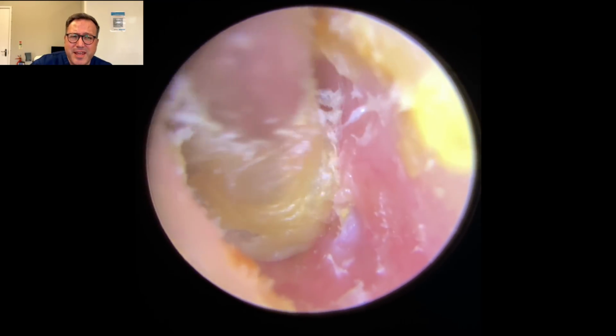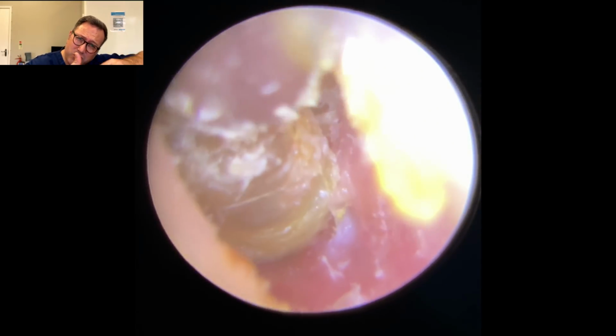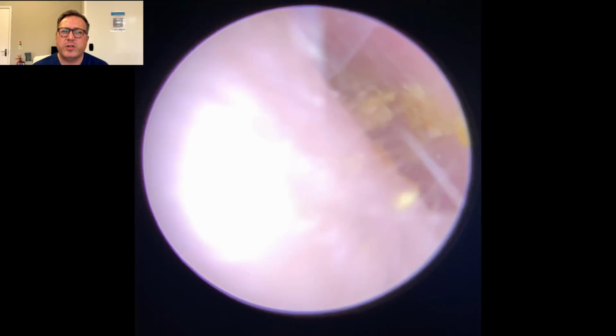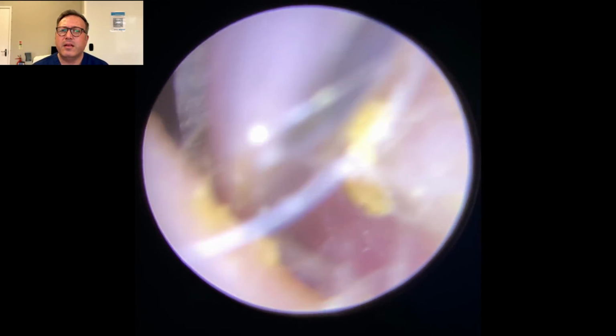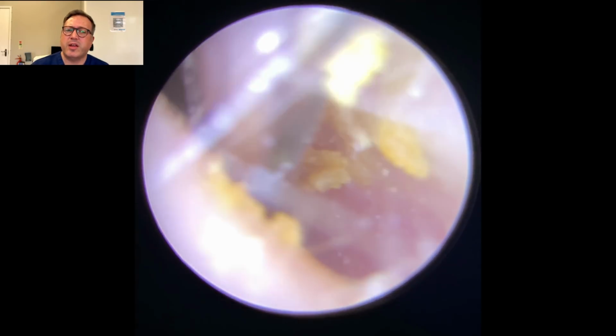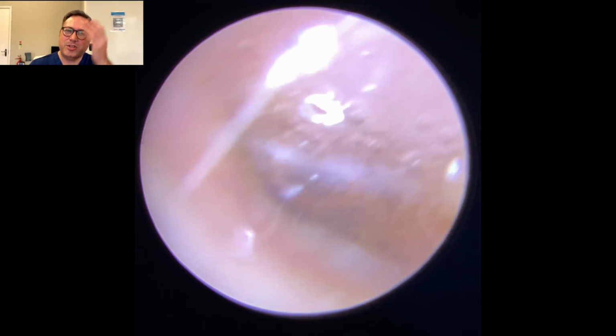You can see that layer underneath. See how it stretches as we pull the wax here. You can see how it stretches and kind of elongates and springs back into position. So it's really not wanting to give up the fight here at the base of the canal. I'm just going to try with the crocodile forceps again. Sometimes you're lucky in those drier pieces as you lift them, that some are a little bit drier than others and they'll pull through, but it's just shearing straight through.